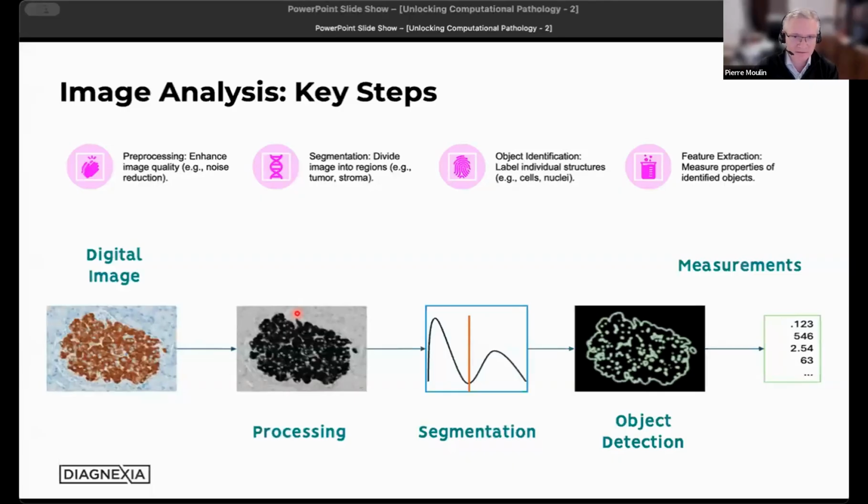In general, there are four key steps in image analysis. And it's valid for many aspects of image analysis, and it's particularly the case here for histological image analysis, probably very much so for analysis of immunohistochemical signals, singleplex like DAB immunostaining. The illustration here is an islet of Langerhans stained for insulin. So it's a good playground to start with.